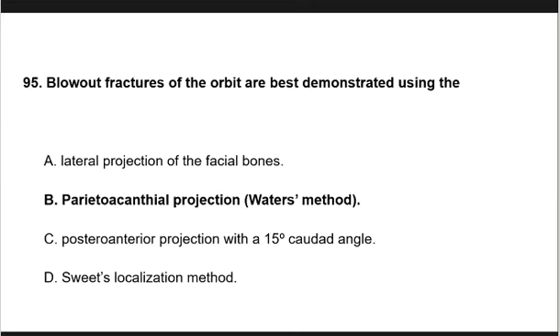Other name: parieto-acanthial, Mahoney's method, Waters method. 1, 2, 3, 4, 5. Occipitomental. Ayun, no? Yan, Miss Tagaro. Angelo. Occipitomental, na? Parieto-acanthial, Waters, Mahoney's method, and occipitomental. Bakit tinawag na occipitomental? Because the X-ray beam enters in the occipital area or in the occiput and exit in the mental or symphysis menti. Kaya tinawag na occipitomental. Okay, next question.